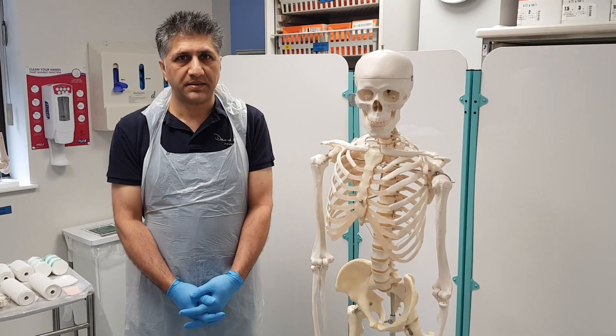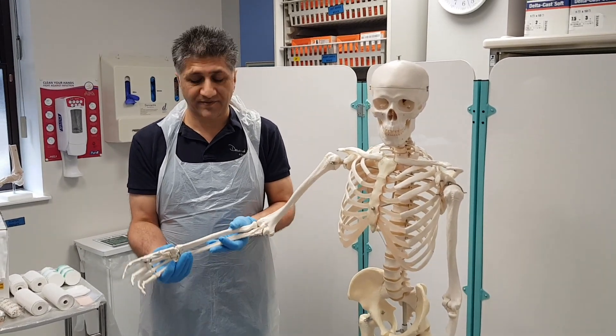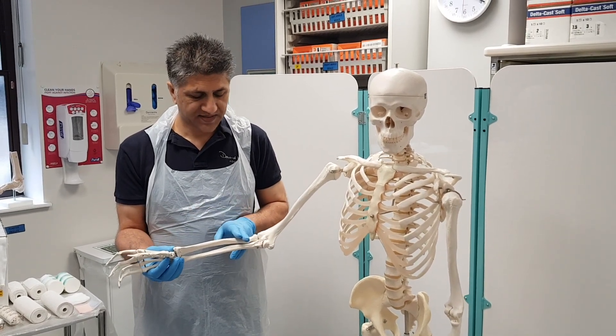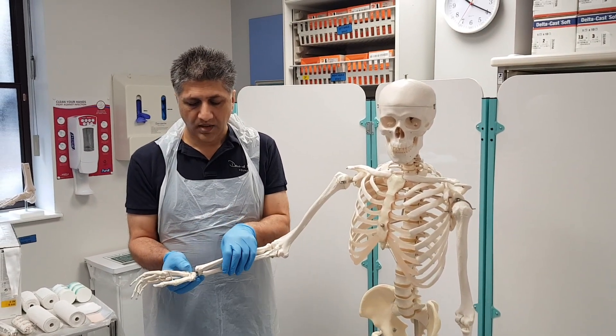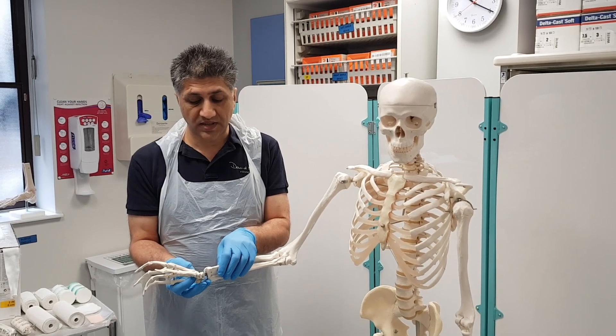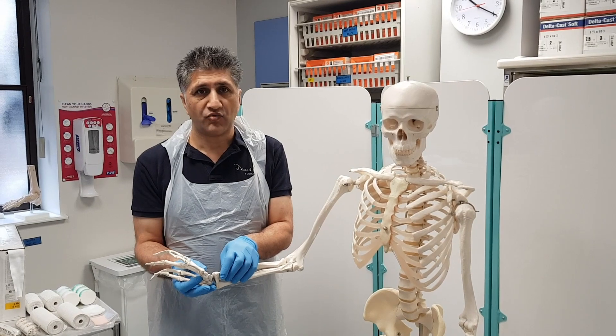First of all we're going to demonstrate a below elbow backslab. The below elbow backslab is generally applied for fractures of distal radius and scaphoid. We want the plaster to go from just below the elbow to the metacarpal heads. We are applying the plaster to a fracture which is generally dorsally angulated, dorsally displaced, and radially angulated.